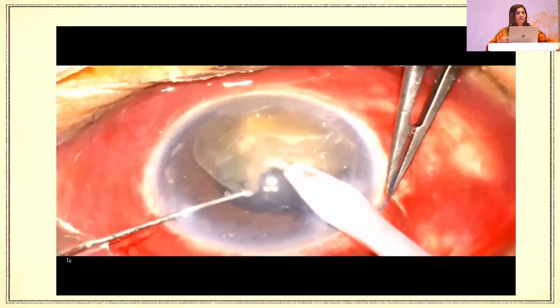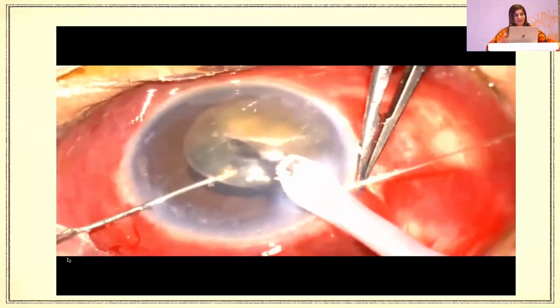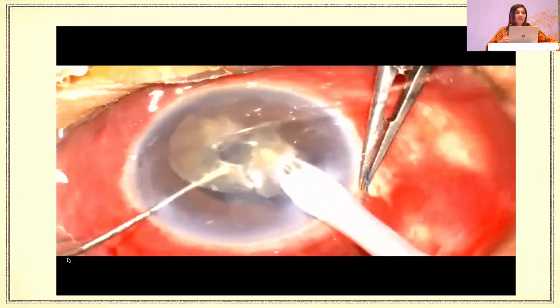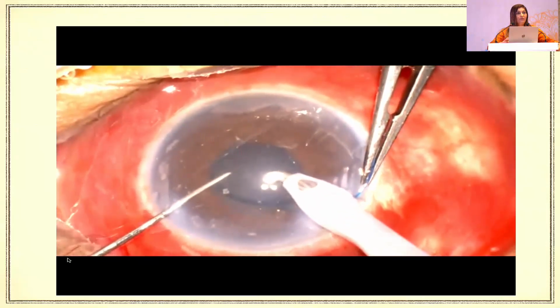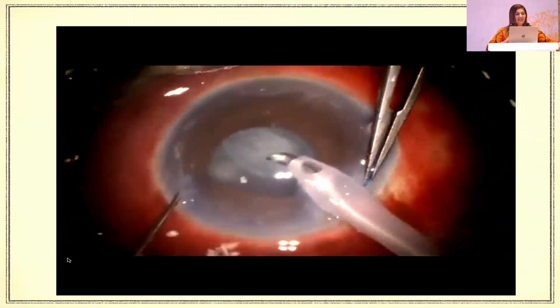Alternatively, many surgeons just inject this intraocular lens onto the sulcus, because if you know your rhexis is very good, you place it on that and then you can emulsify. Alternatively, they also put the leading and the trailing haptic onto the surface of the iris, and then they do it. So it all actually depends upon the clinical scenario that you are having during the surgery. But in this case, nothing was seen.